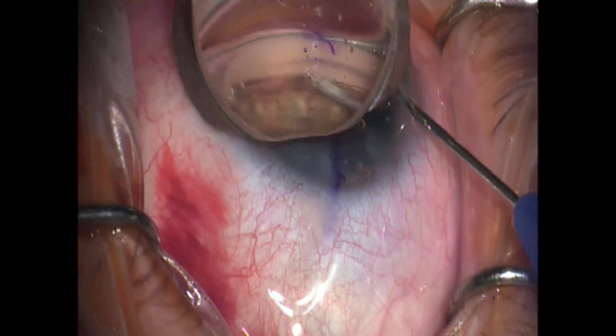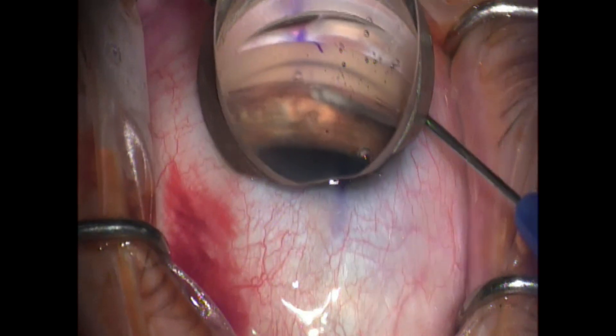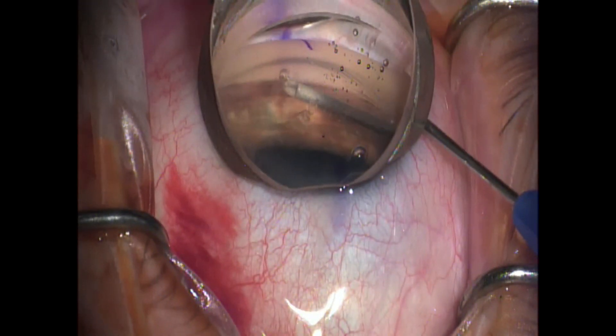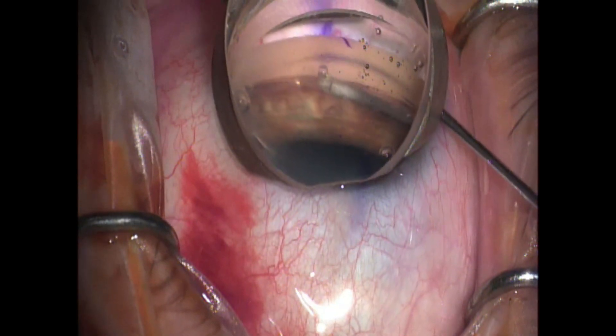What you have to remember with this specific device is you have to move forward very lightly with the injector. As you slide the roller forward, I usually use two fingers to do it so I can do it in a very methodical and precise manner. As that rolls all the way forward, that illuminated tip will show you when it's reached the end, just like it did in the original cannula. You can see it right at about where I am right now, right at the beginning of my wound.